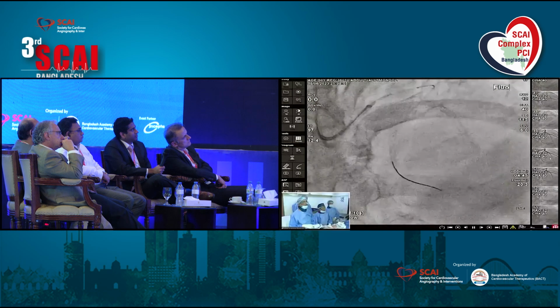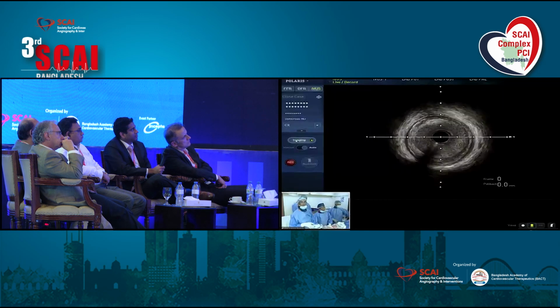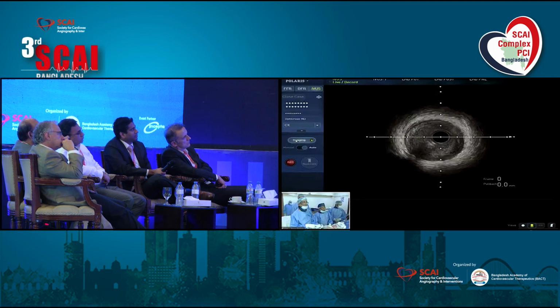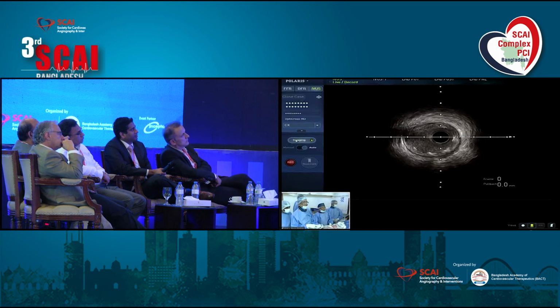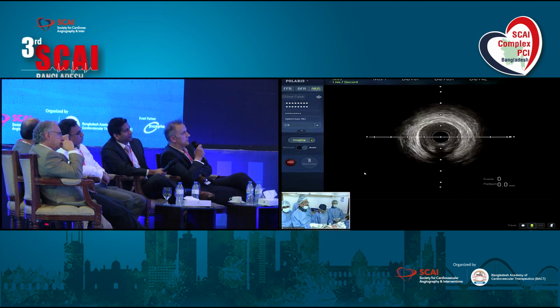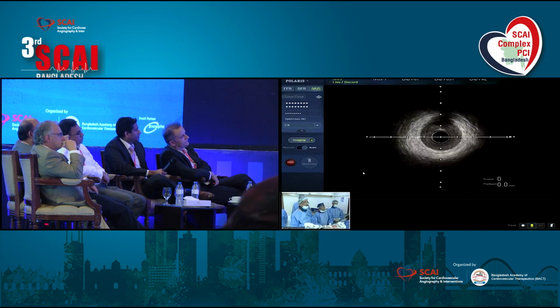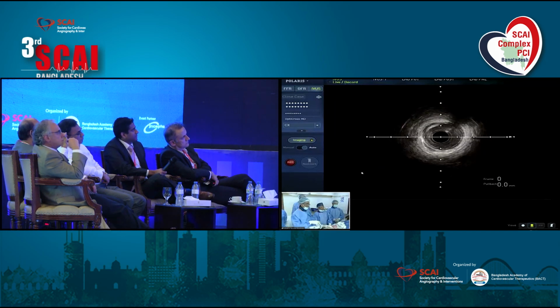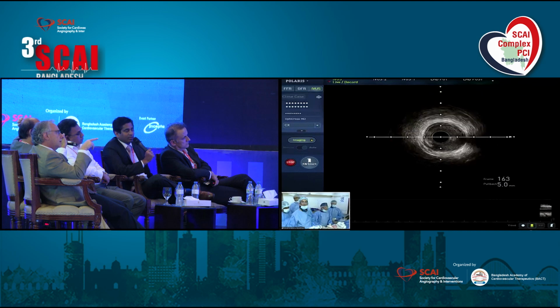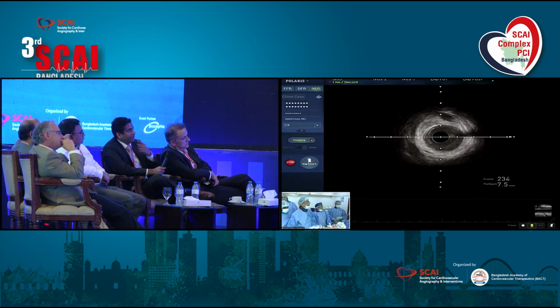Yes, we are going once again with IVUS. Push your wire first. For the younger colleagues, how to introduce the IVUS to a long lesion or distal lesion? You will pull the wire and push the catheter with the wire. Under-expanded in the calcified segment. Show them. Yeah, they're seeing IVUS now.